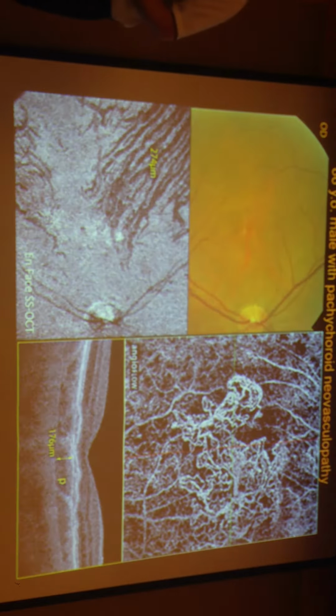Are you referring to the patient with pachychoroid and PCV? Yeah, this slide. Because how do you differentiate from the patient with PCV?